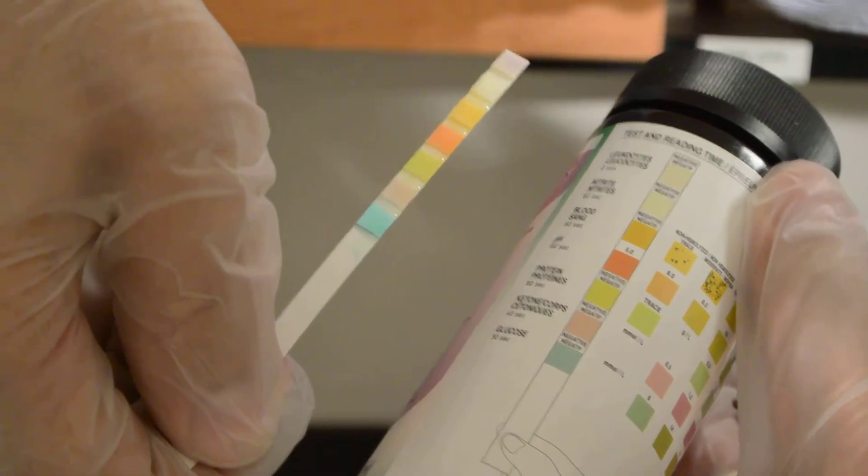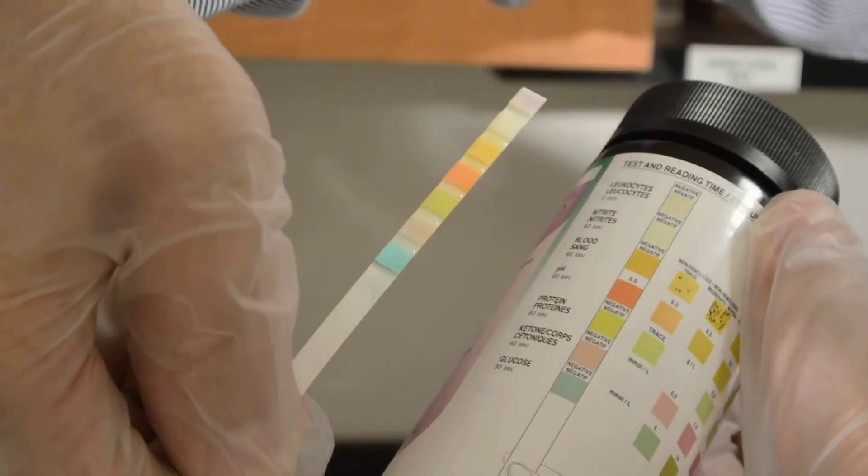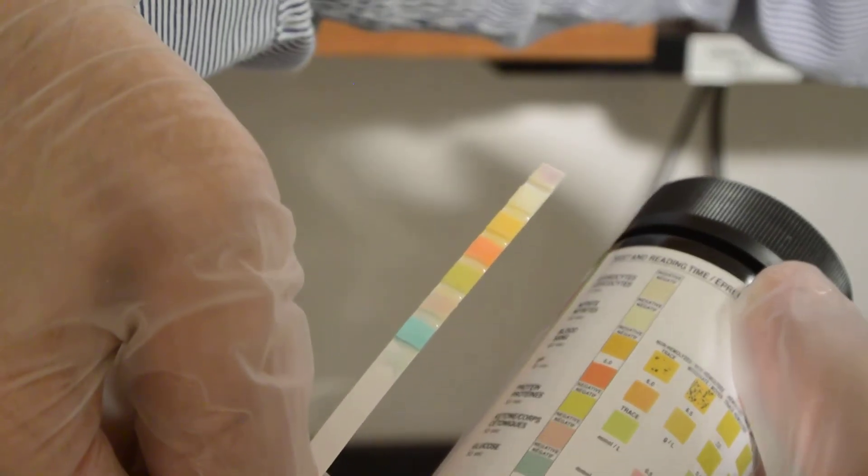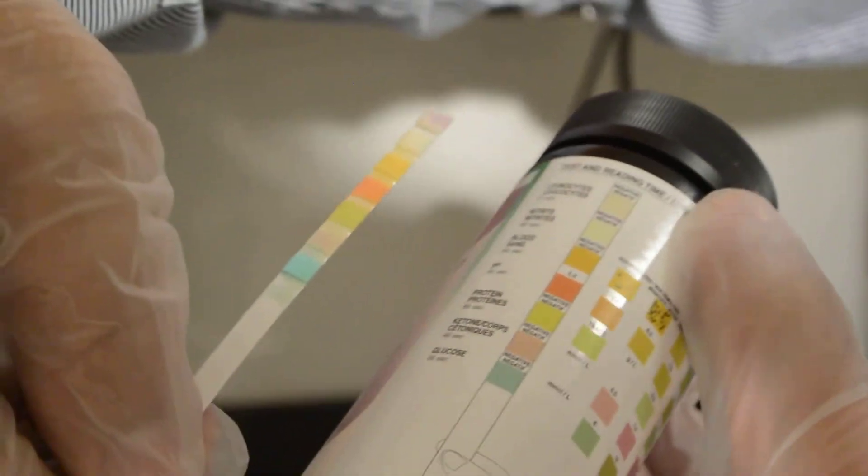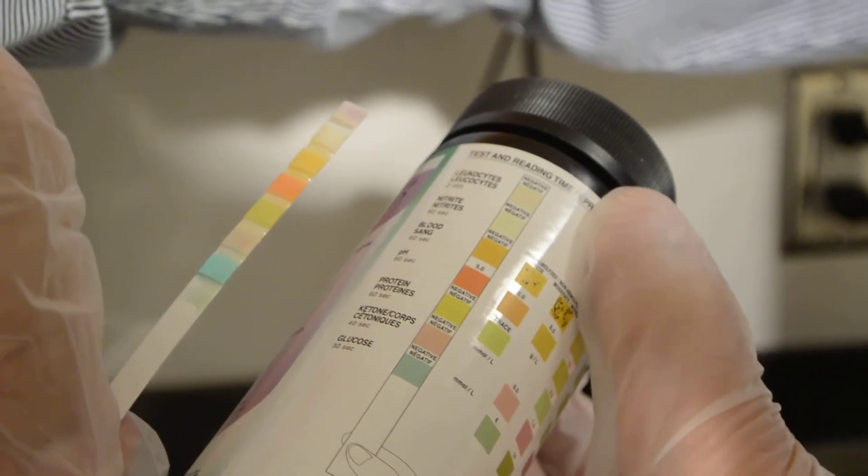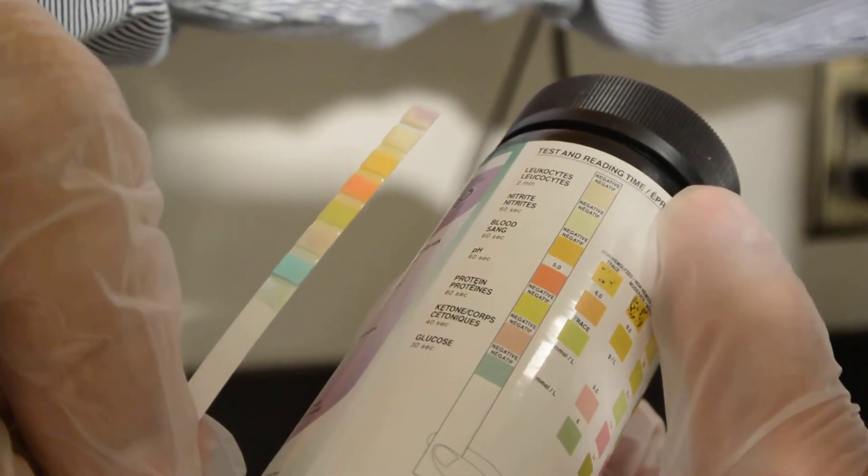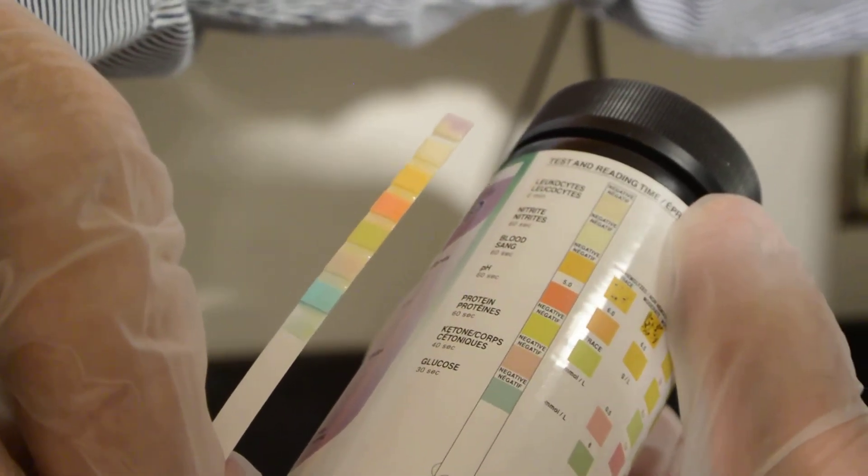What you do is compare the color of what's on the stick with the color on the container. Realize that some might take 60 seconds and some might be quicker to give you the result.